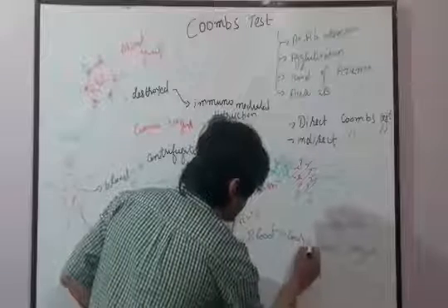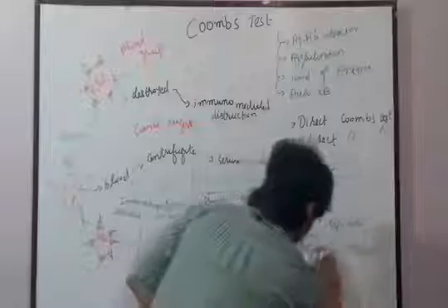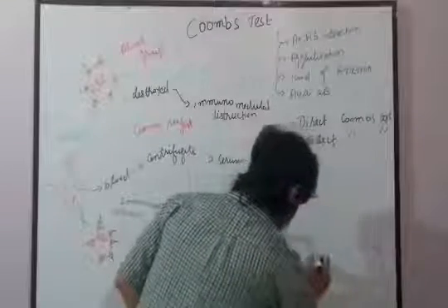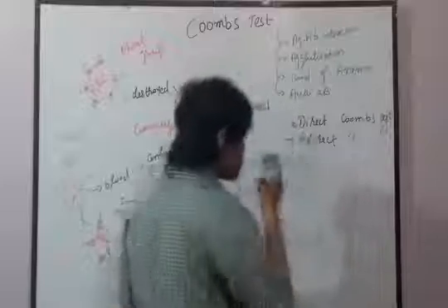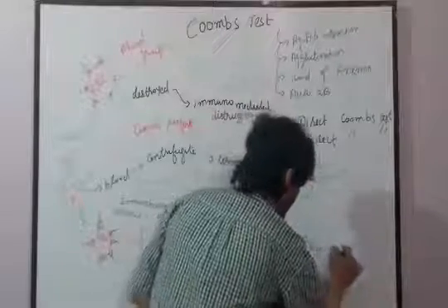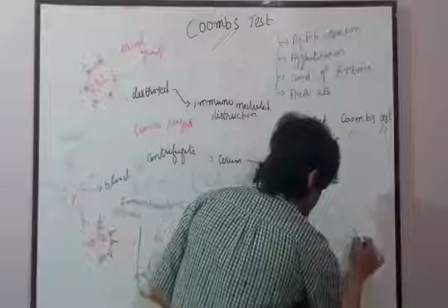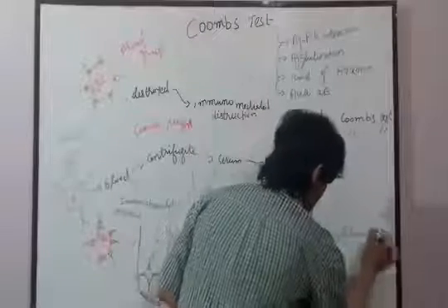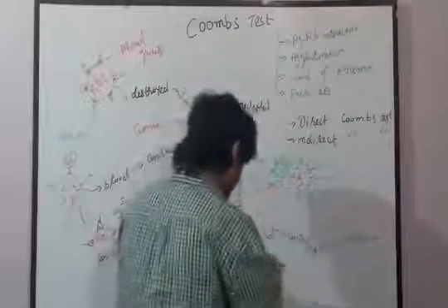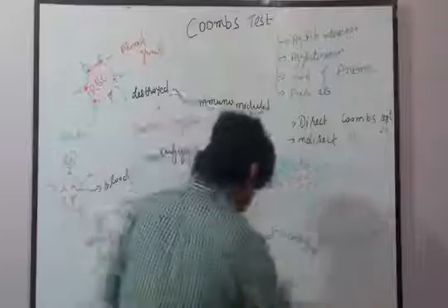Centrifuge. Let me erase this one portion. We simply centrifuge it. Once we centrifuge it, we separate the serum portion, and we put this serum into a test tube. Let me draw the test tube here.